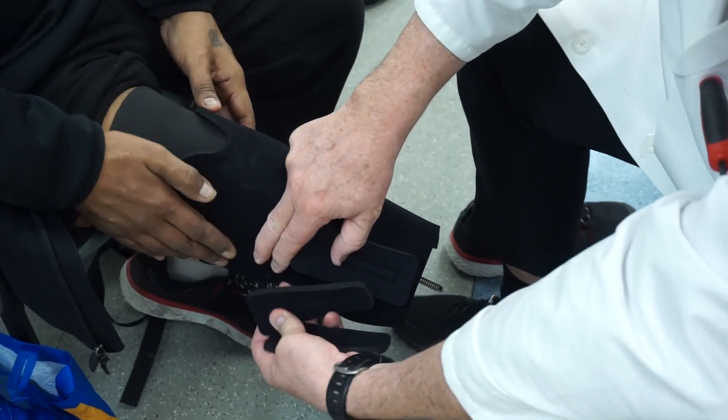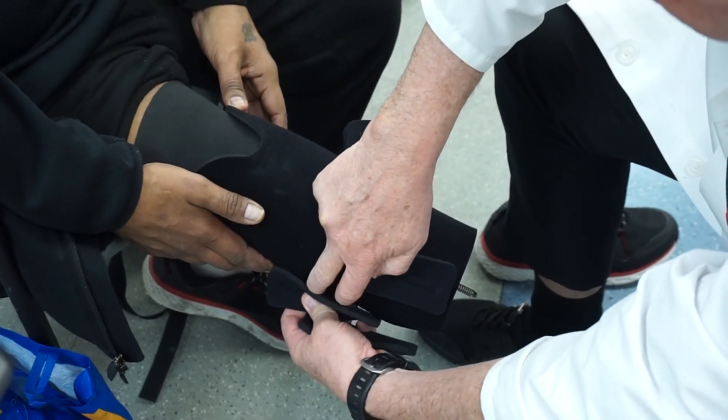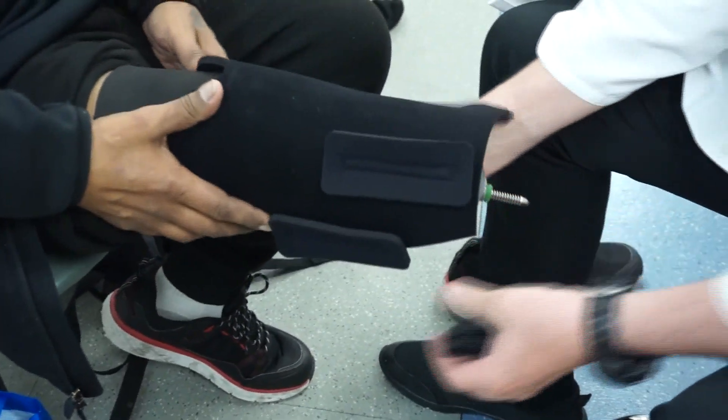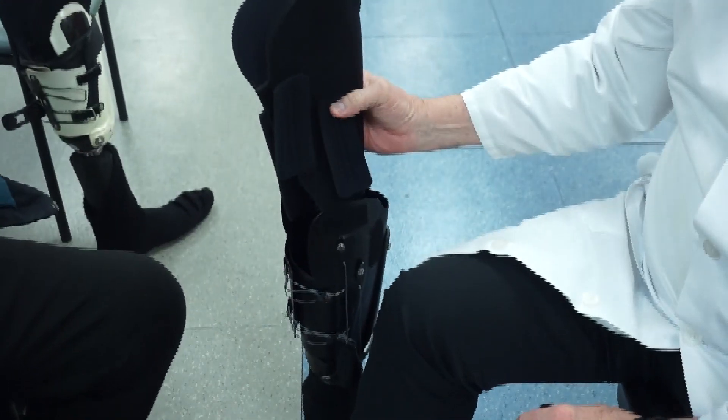Our pad kits easily fit to where you need them and allow us to do that. Then you remove this and put it back in the socket.